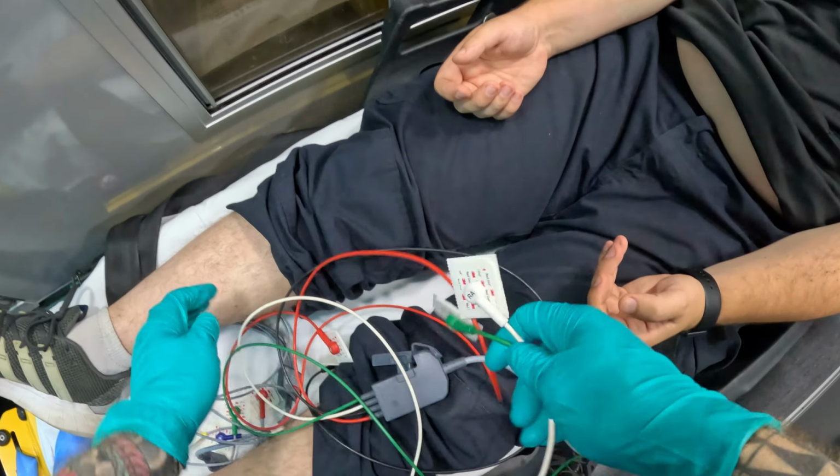Calf, right? I'm putting them basically on the areas where it's cleansed. And then relish. Relish is green, right? Again, calf. So if I'm looking at the patient, I'm going to say salt, pepper, ketchup, relish, and we're going in a clockwise motion. So this is your limb leads.